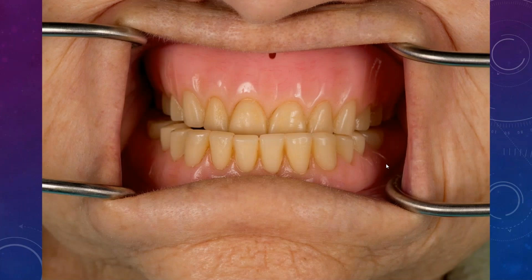What if you have a case that looks like this? Patient has an existing denture they've been wearing for a while, the vertical has collapsed, and the patient has an acquired class 3. Can you use that for planning of your future dentures and your future implant placement and surgery? No, you can't do that because this is not their proper occlusion, this is not their proper vertical, their proper aesthetics, and their proper function. So you want to restore them to that first, up to a certain point, obviously, and only then do the surgical guides and everything else.